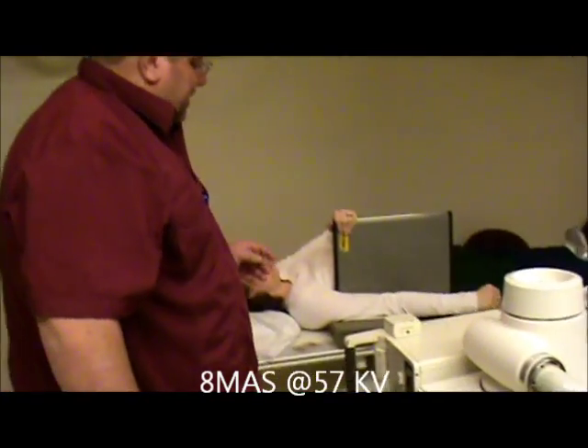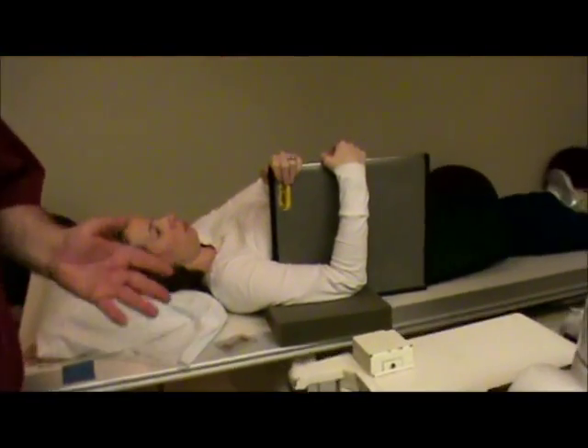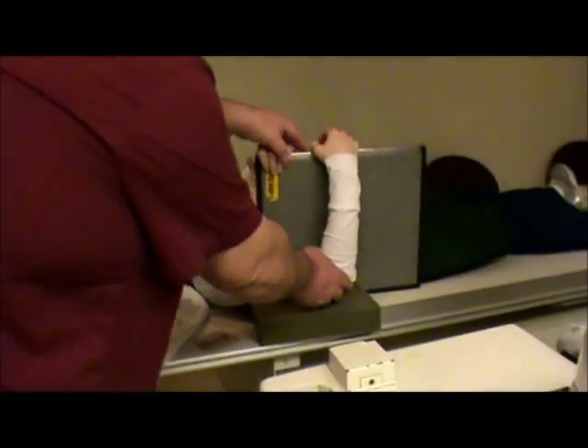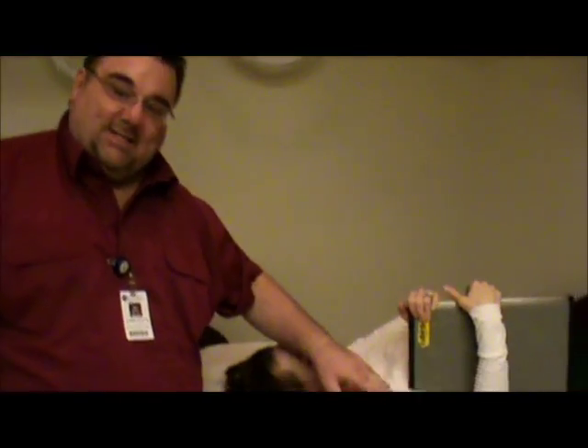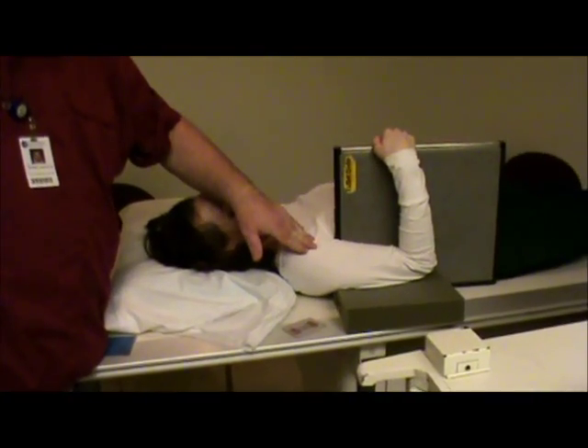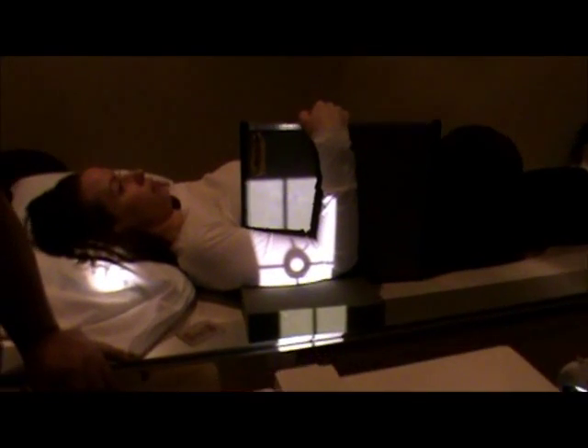If the patient can keep their arm bent, we'll try to get it bent. If they can't, we can lay it out flat — whatever way the patient can manage. We're going to get as close as we can to the film. The film will go up into the axilla as far as it can possibly go. Then I'm going to move up and down the arm until the collimation comes in to the elbow and reaches the top of the film.